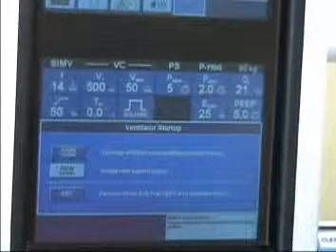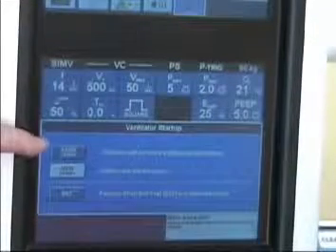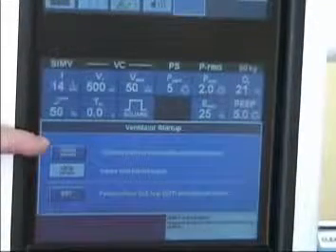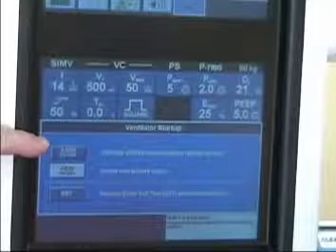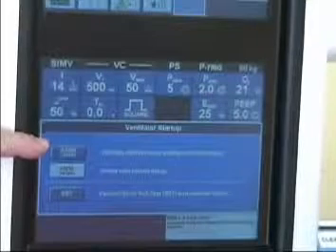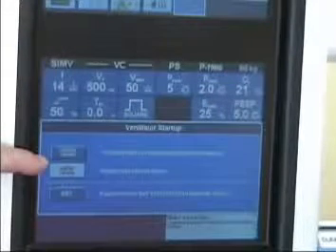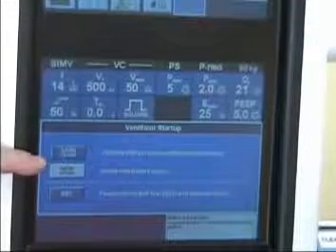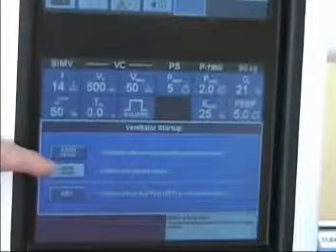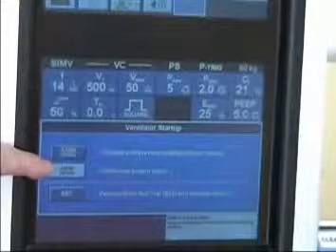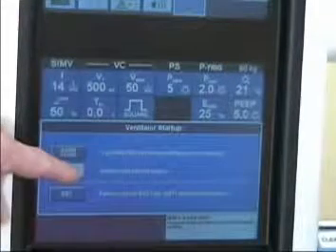If we're going back on the same patient, we would touch the top box, same patient. Or if we are doing a new patient, we will press the second box which says new. So let's touch that.